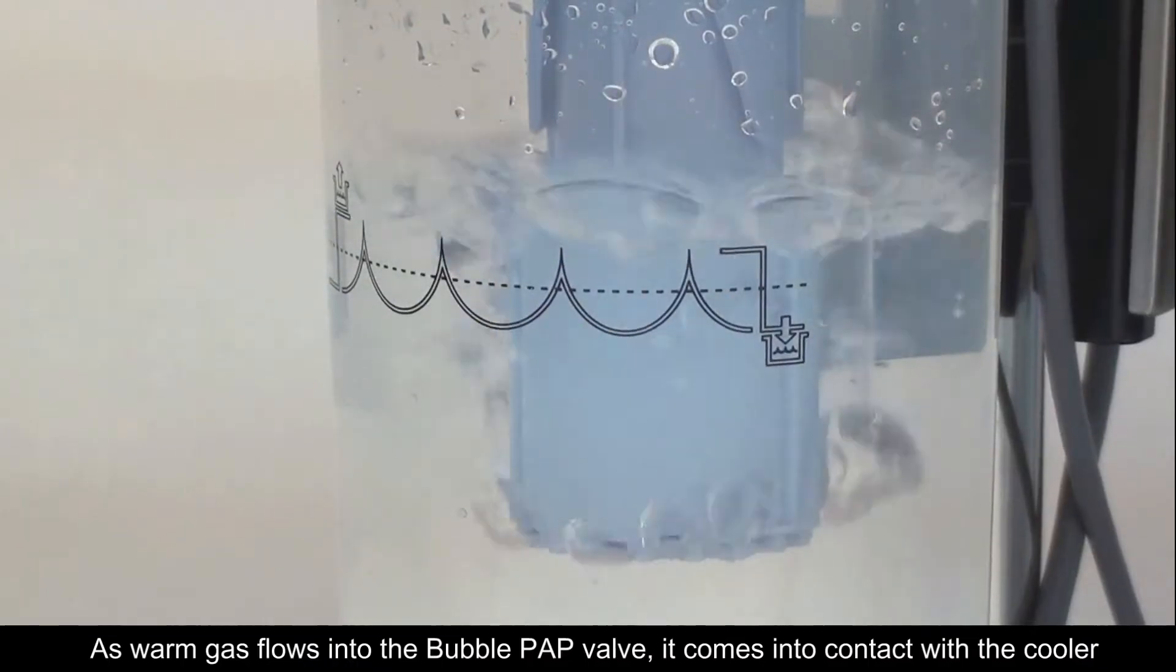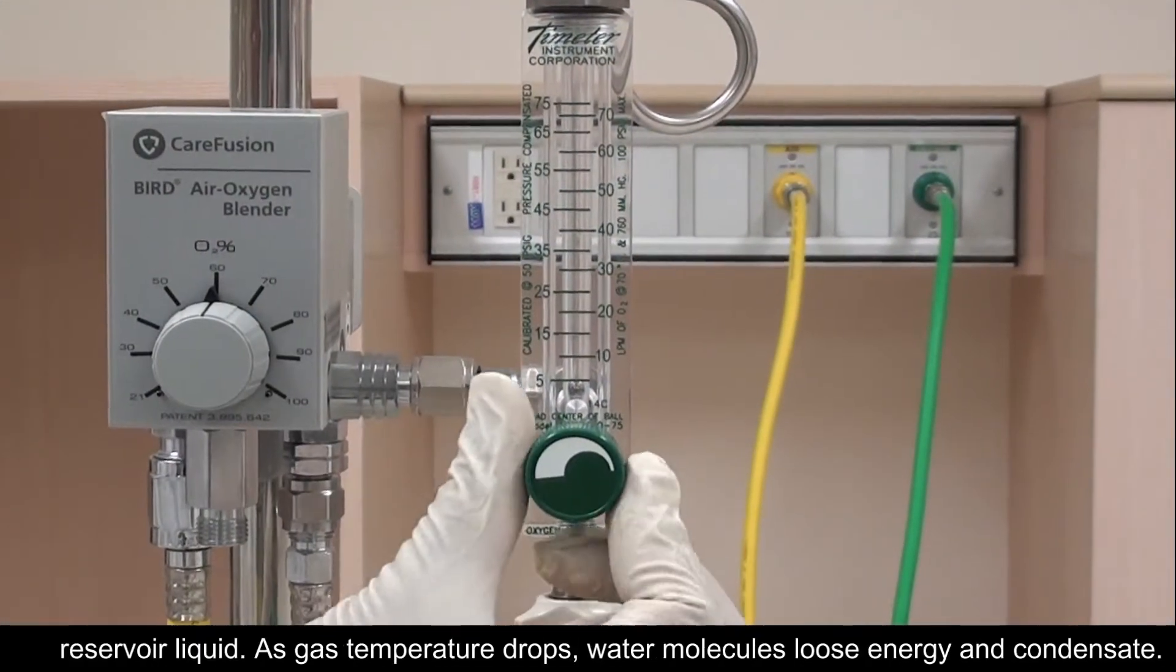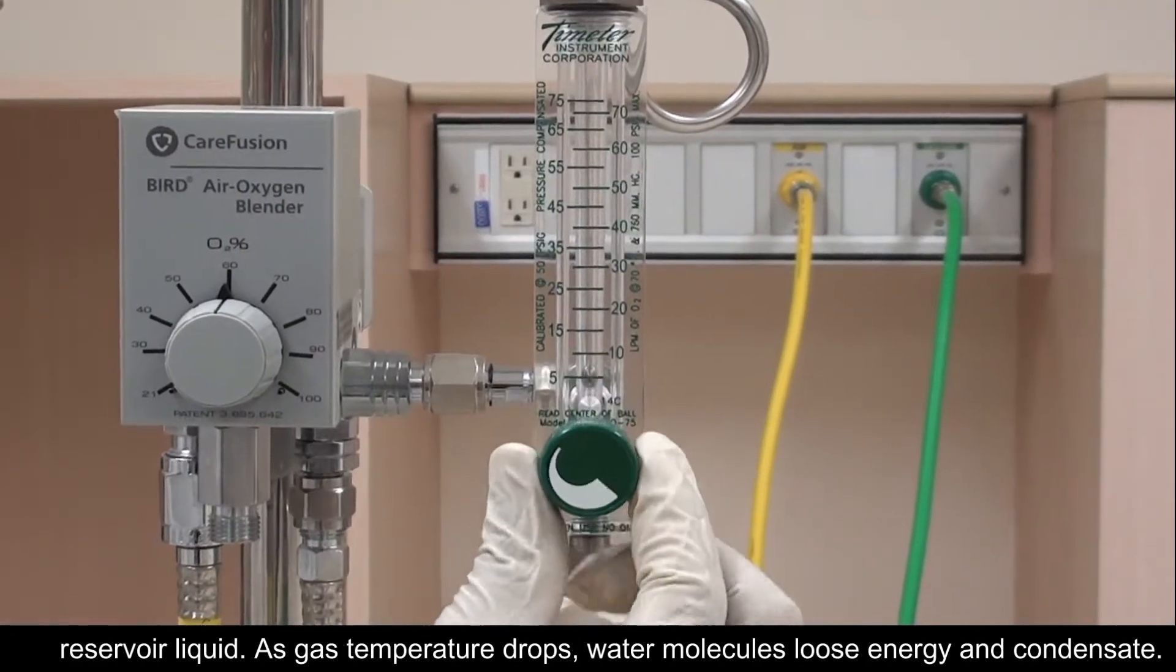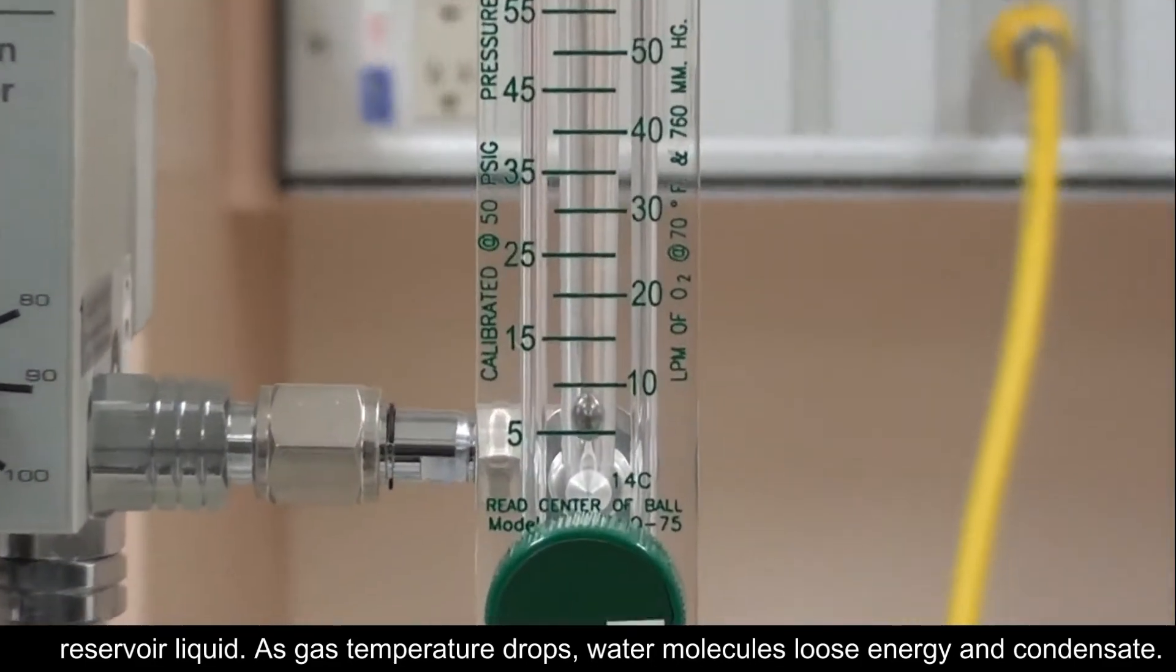As warm gas flows into the Bubble PAP valve, it comes into contact with the cooler reservoir liquid. As gas temperature drops, water molecules lose energy and condensate.